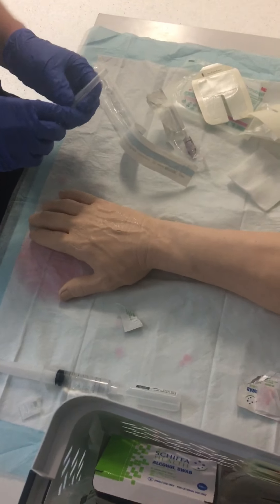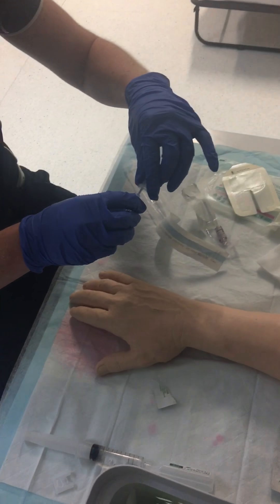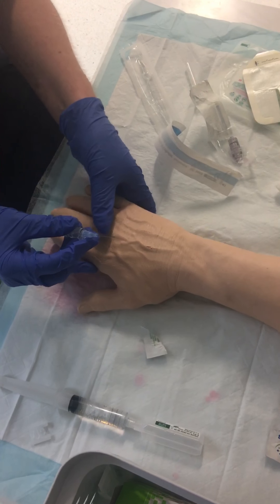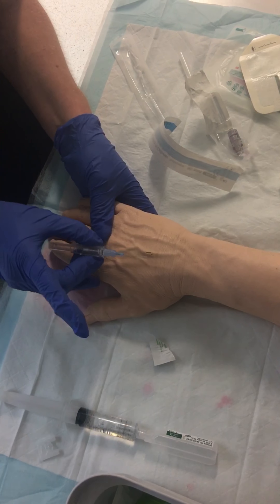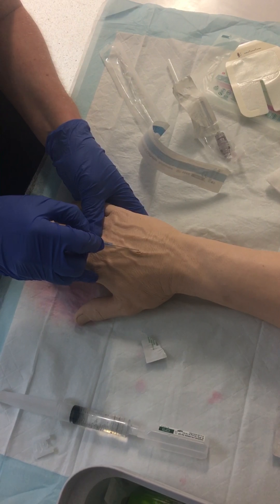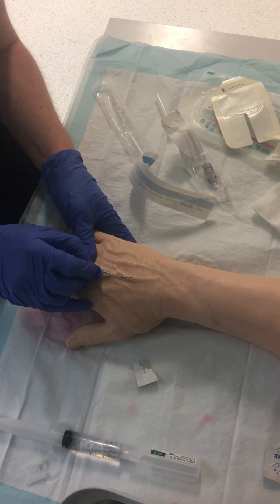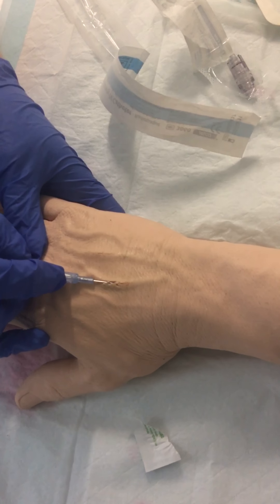I would also have a sharps container within reach. Now I'm just warning the patient that I'm going to give them a bit of a sharp scratch. I'm going to hold the cannula with these two fingers and put another one on top. I'm going to insert the cannula at about a 15 to 30 degree angle, and when I get a flashback, I'm going to lower it and advance it a little bit more, then advance the cannula.